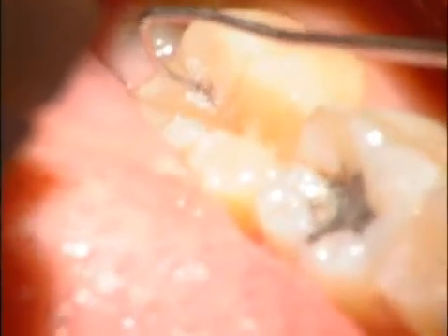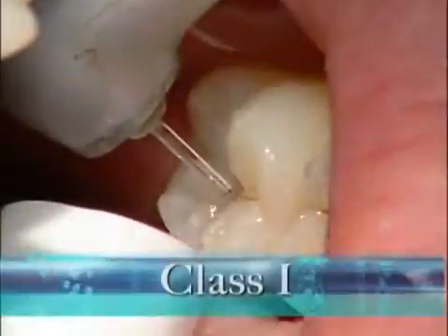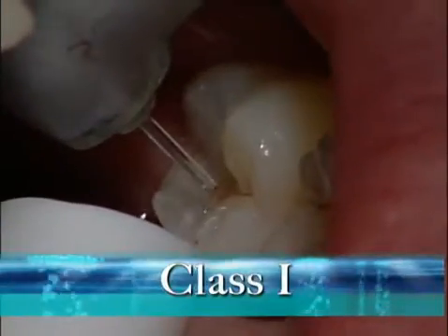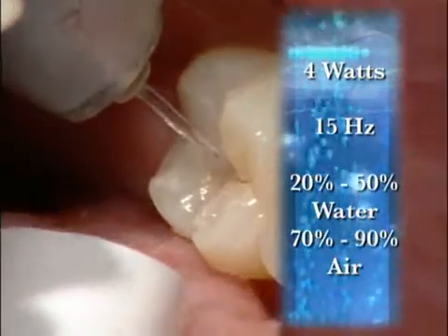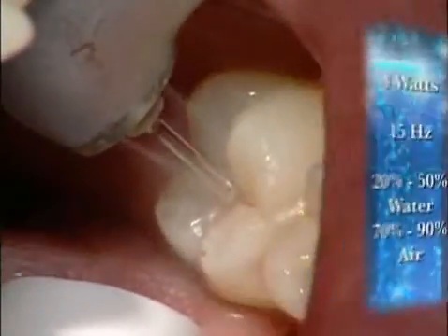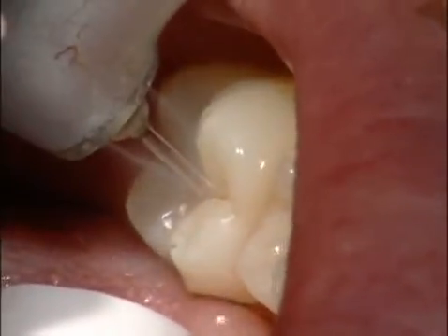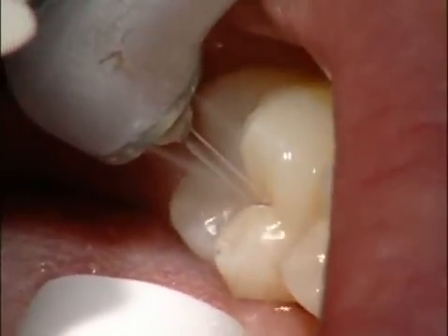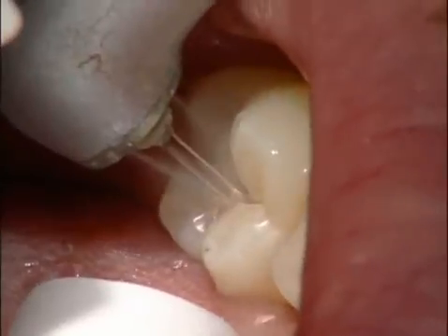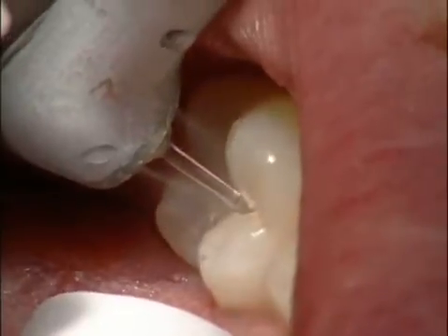I also find that in some patients, the deeper you get into the occlusal dentin, occasionally they become sensitive. So what I do is I change to 4 watts. I leave my water 20 to 50% and the air 70 to 90%. I change the hertz from 30 down to 15. So with the MD, we're able to have a wider range of laser settings to allow us to more comfortably work on our patients.